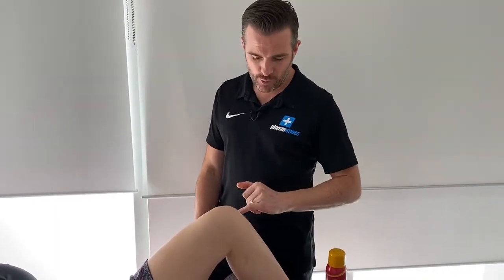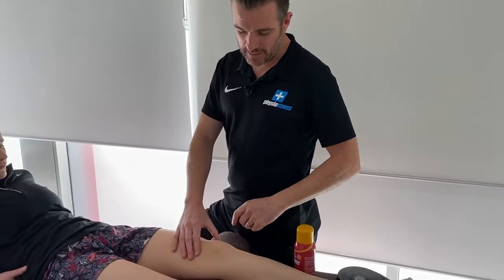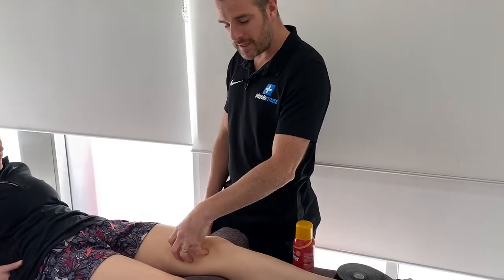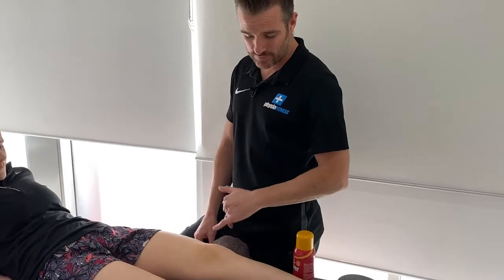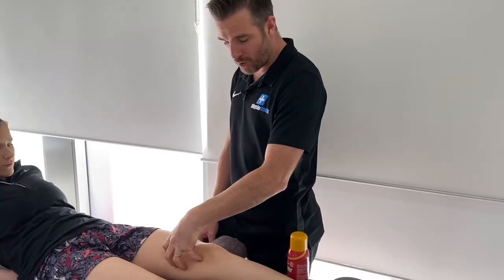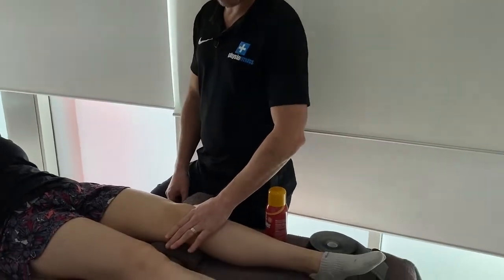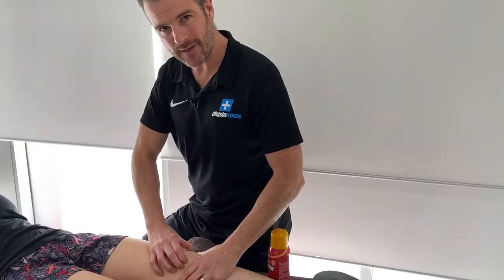This is used for people who are either swollen under the kneecap, maybe they've got some wear and tear, some chondromalacia patellae, something's going wrong with the undersurface of the kneecap. Or there's someone who has significant VMO weakness — someone who's had a patella fracture, surgery, or dislocation and has lost their VMO and is trying to build it back, but has real trouble with single leg squats, leg extension movements, and similar exercises because of the lack of bulk, and they're getting a lot of patellofemoral pain. This taping really helps give them a lift under there, supporting that kneecap almost like a VMO and quad holding it.